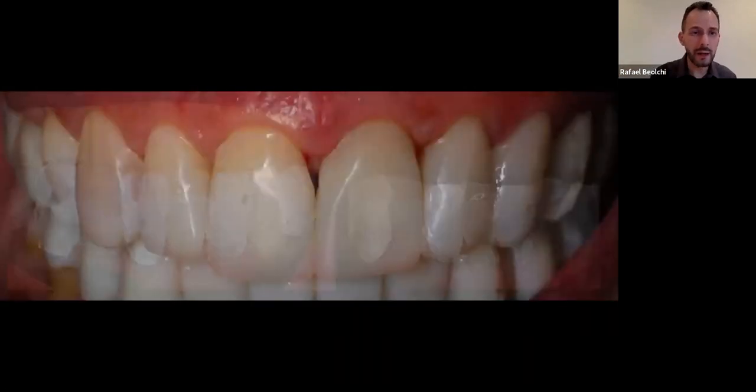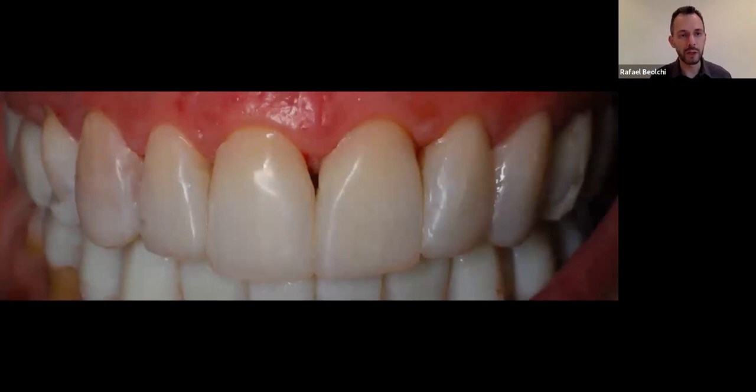And then we're going to start doing the polishing. Talking about the polishing, how do I do polishing? I do all the steps in the same appointment. Okay, all the steps in the same appointment. So what we're seeing here is immediately after.